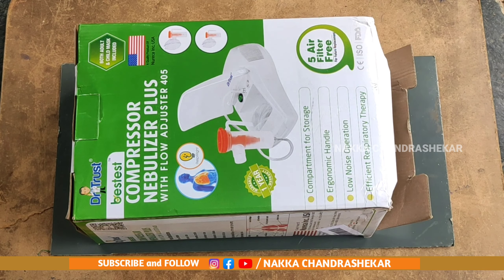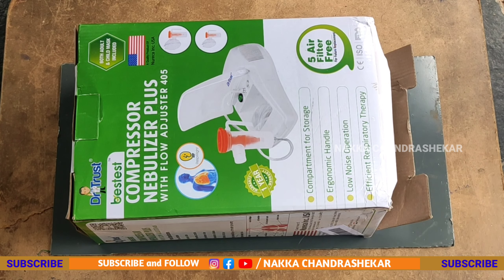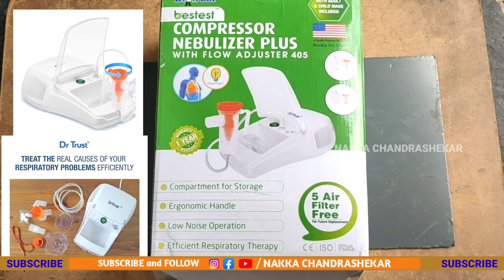Hi friends, my name is Naka Chandrashekar. Today I am going to try out the nebulizer. I am going to show you a new unboxing.